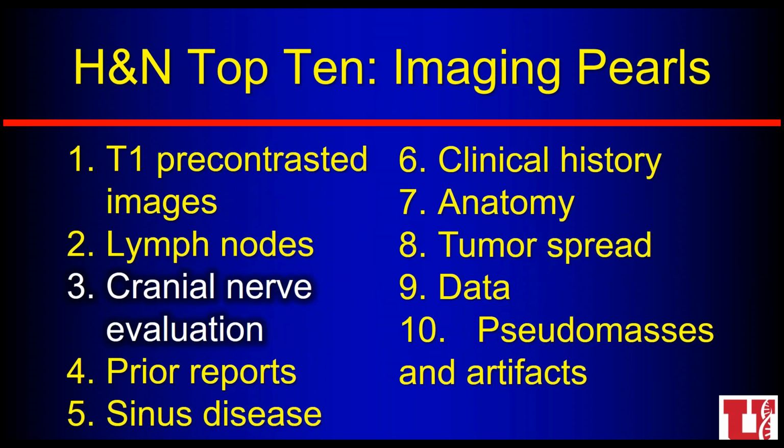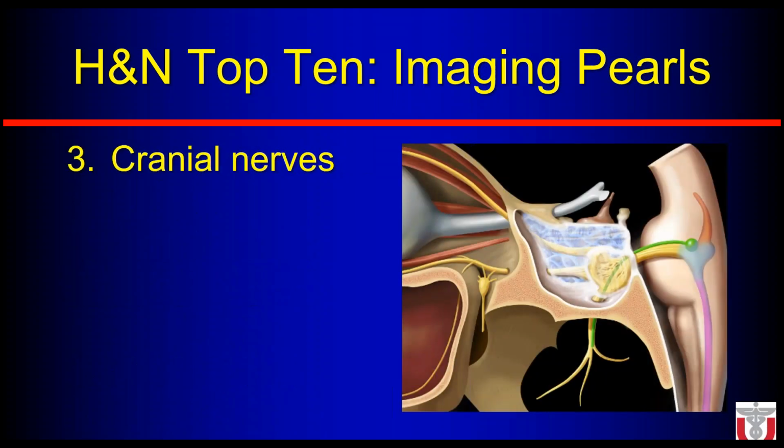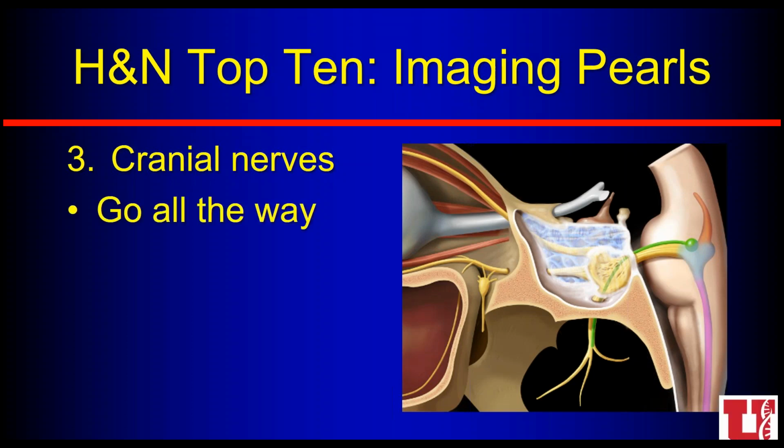Anytime we're thinking about cranial nerve evaluation, we want to think very importantly about the anatomy of that nerve. So if we just have a patient who has a significant pathology, if they're not moving the right side of the body and we're thinking about ischemia in the brain, that's very different. But anytime we have an isolated cranial nerve deficit, we want to think about imaging all the way through the nerve. So from the origin nucleus all the way out through the end organ.